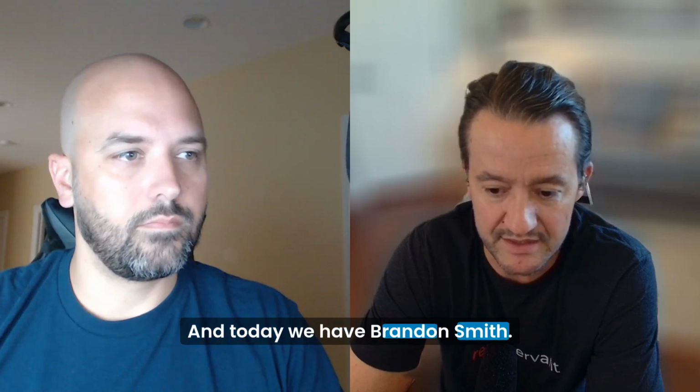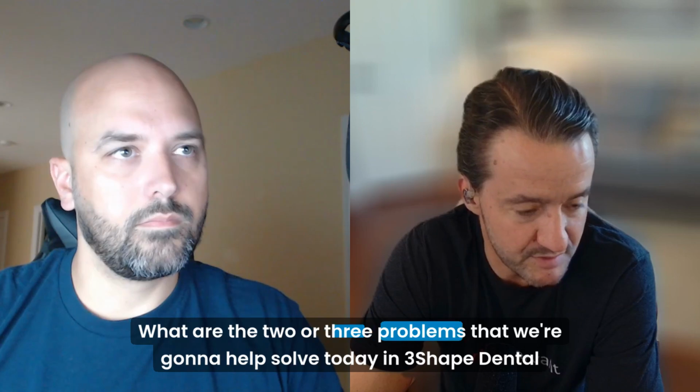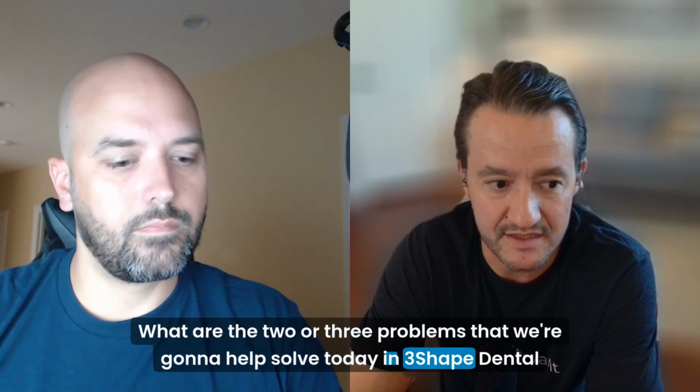And today we have Brandon Smith. Brandon, talk to us really quick. What are the two or three problems that we're going to help solve today in 3Shape?